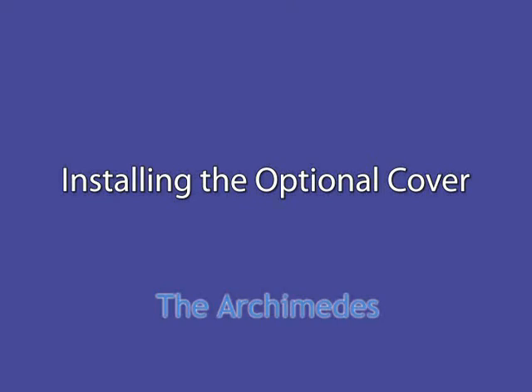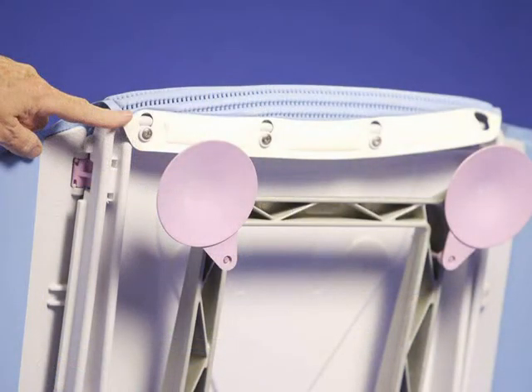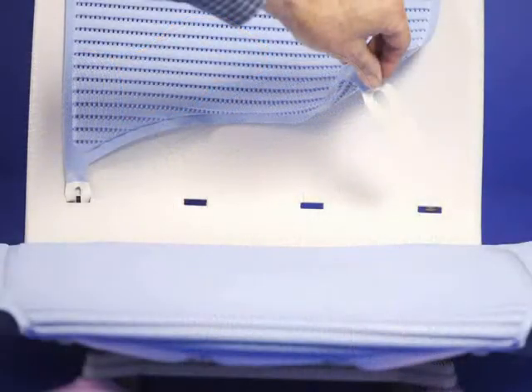If you purchased the optional cover for your Archimedes, the following slides show you how to install it on your bath lift. Slide the cover over each transfer flap, then place the openings in the front edge of the cover over the retaining posts on the underside of the seat. The back cover is placed over the top of the backrest, then the tabs are inserted through the slots to the retaining posts on the rear of the backrest.